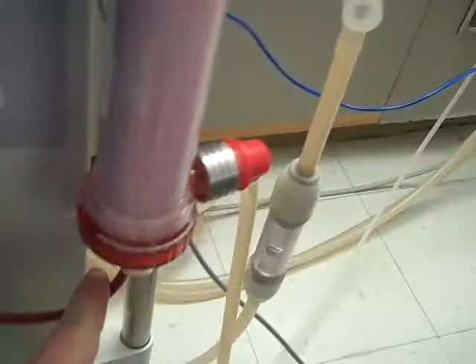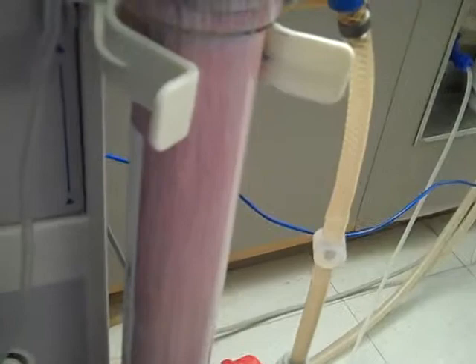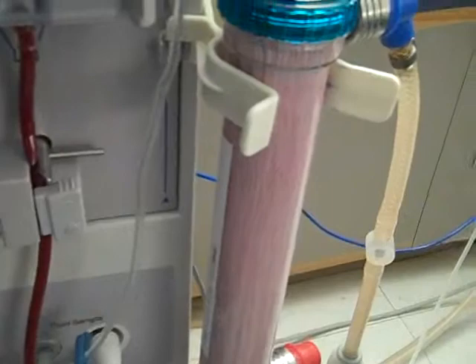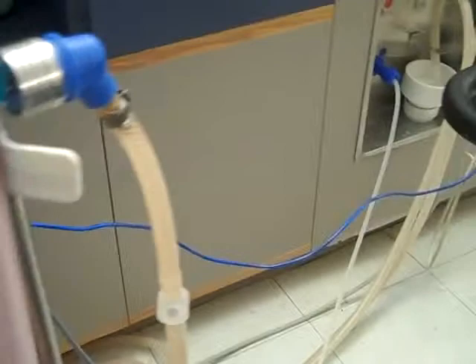The blood runs through here, down, and then up into the dialyzer. The easiest explanation is that it's kind of like an oil filter, except that if you look really close, you can see microscopic little straws. The blood is running through those straws, and all around those straws is a fluid called dialysate. It acts as a semi-permeable membrane and it allows the toxins and extra fluid to come off the patient through here and then out through these ports.